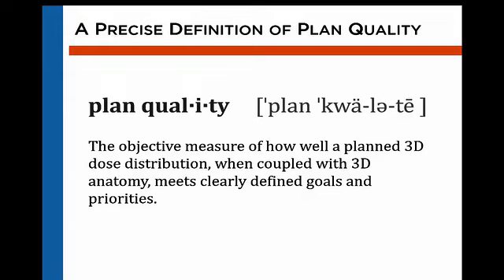So notice this doesn't necessarily mean how accurate the dosimetry is, either delivered or planned, nor is it the accuracy of the contouring that goes before it. This is the singular part of the component where everyone is given a fixed set of anatomy and structures, so everyone's using the same human design, and then they're given a very specific set of goals and a transparent set of rules against which they'll be measured. That will produce a plan and a dose distribution, and then we can gauge in a quantified manner how well did each planner or planning system or delivery system meet those desired goals.